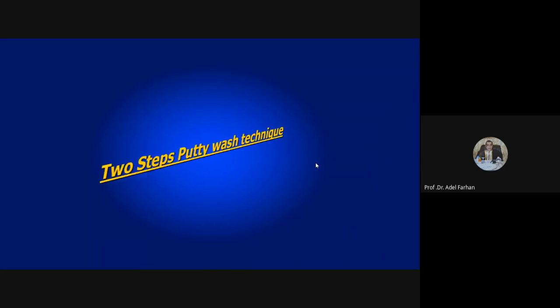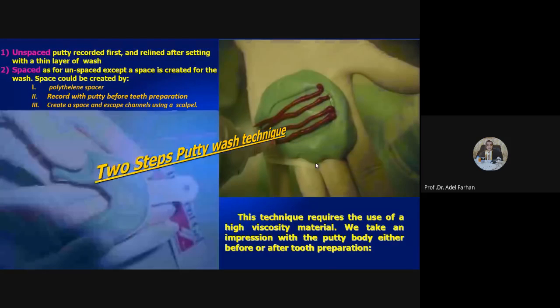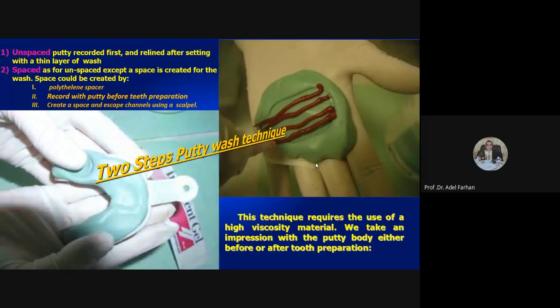عندنا التكنيك الثانية اللي هي التو ستيب تكنيك. As we say, we have a space and unspace. طبعا هنا بهاي التكنيك عندنا تو فيسكوستي، واحدة باتي واللوك شنو؟ عندنا اللايت الووش. اللايت طبعا يسموه ووش لاير. اوكي عندنا هيفي باتي، هذه تجينا مثل العجينة.